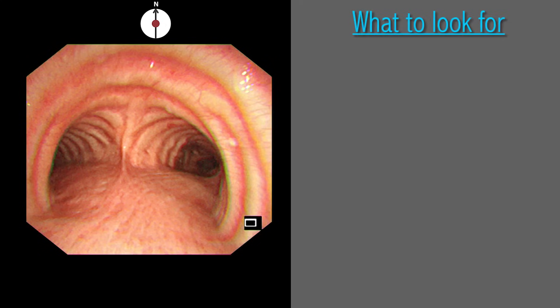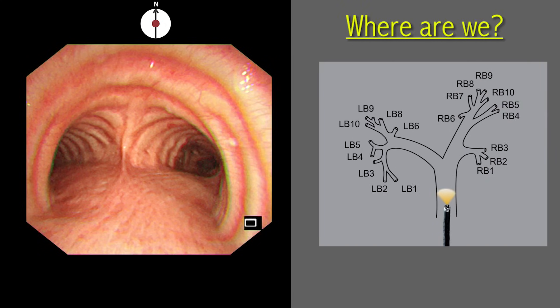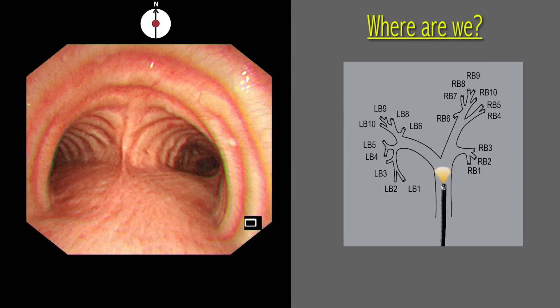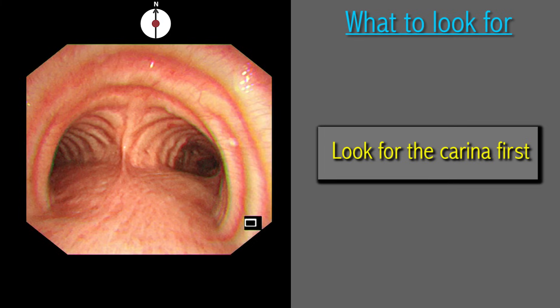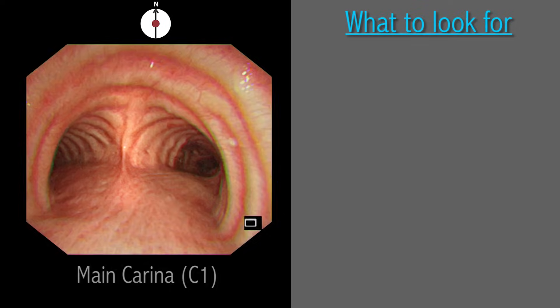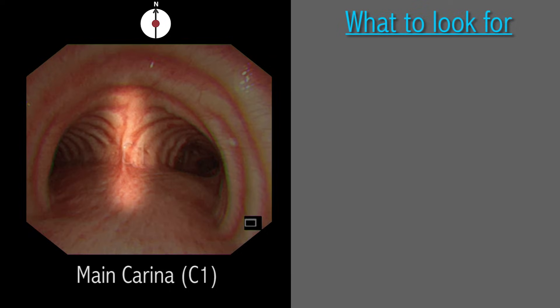As the scope is further advanced and the lower orifices come into light, we tend to notice the bronchial orifices first. In this video I aim to change this basic instinct of seeing bronchial orifices first, and replace it with a new concept of thinking and seeing carina first. To my mind, identifying the proper level of carinae is the secret to diagnostic bronchoscopy. Let us identify the sharp main carina, C1, which is the first level of bronchial division.